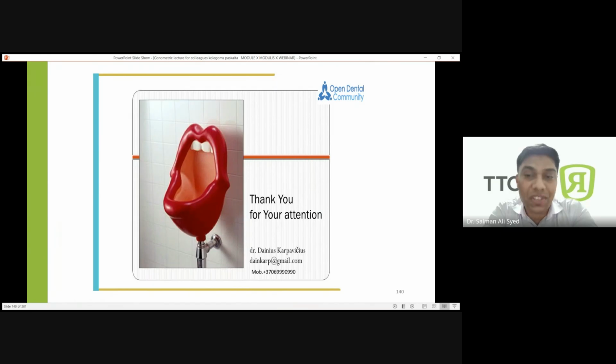Most of the patients, just after 7 days, come to the clinic and say, I'm having some issues, probably because of inflammation, or probably because of cement-retained mucositis. So this gives you the benefit of both. You get the benefit and aesthetics of cement retained, and you get the retrievability of the screw retained.